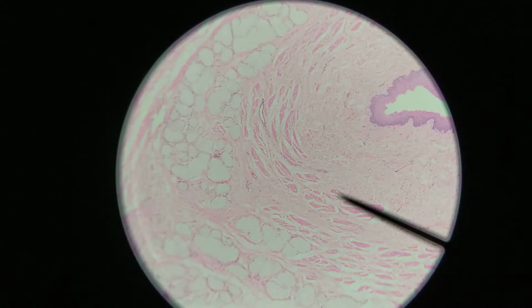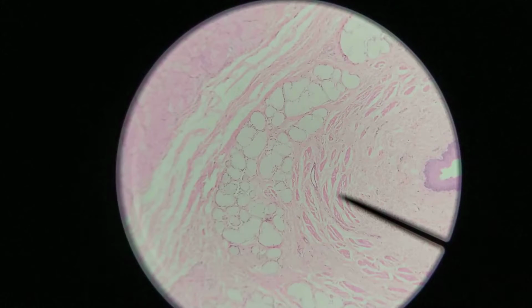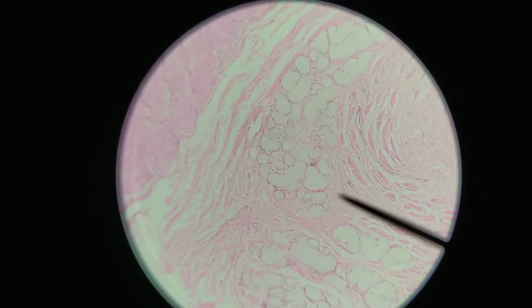Beneath that we see something a little bit more eosinophilic, and so what you're seeing looks like fragments of eosinophilic material. What you're looking at here is the muscularis mucosa. Beyond this is the tunica submucosa, so more of a dense connective tissue layer, and what we're seeing in this region here are some glands. And so what you're seeing here are the submucosal glands of the esophagus.